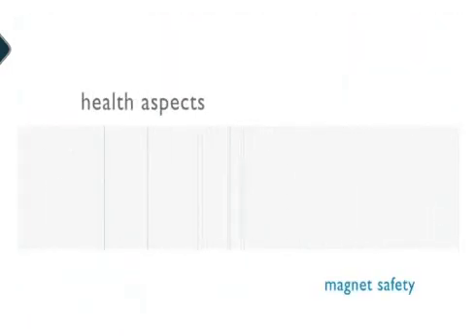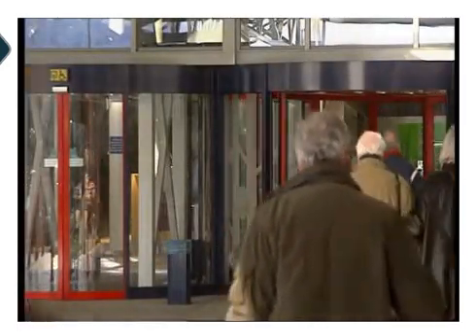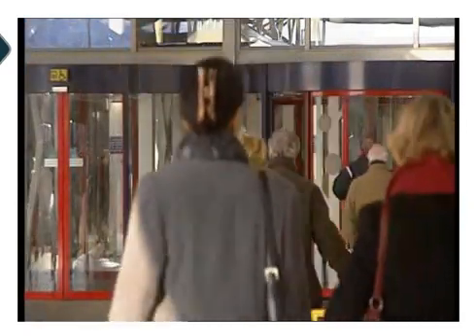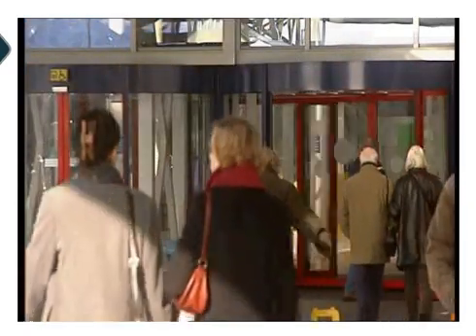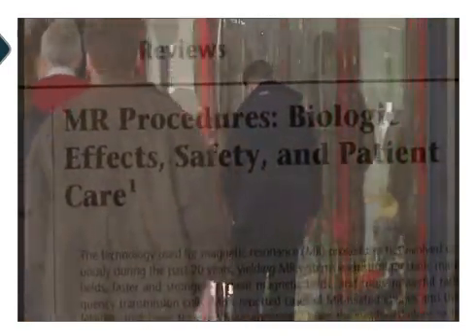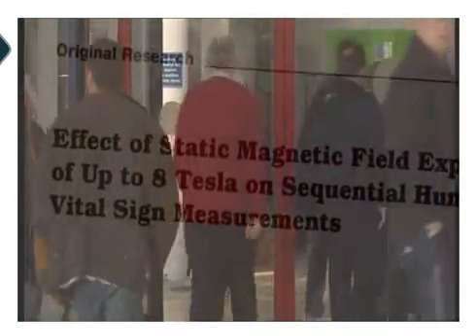Health aspects. Since the introduction of MRI scanners in clinical practice in the mid-1980s, some 500 million patients have been scanned. Most of these examinations have been performed with 1.5 Tesla systems. No long-term negative health effects directly related to the static magnetic field have ever been reported.